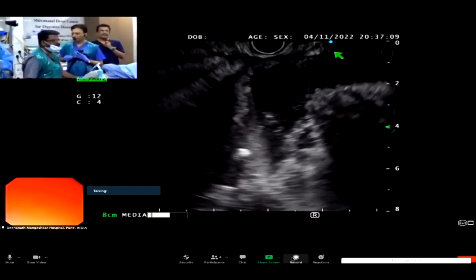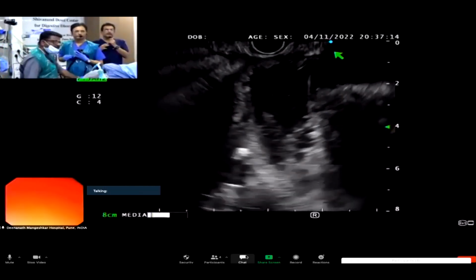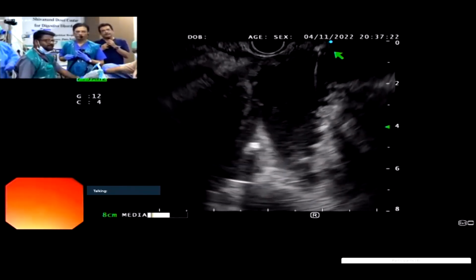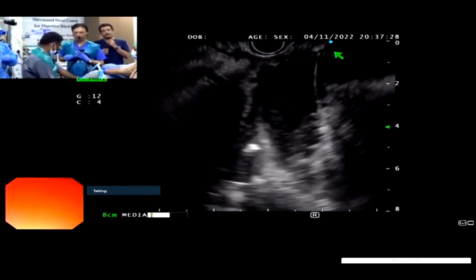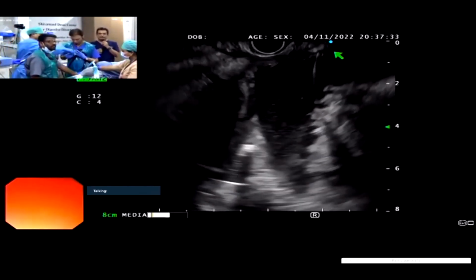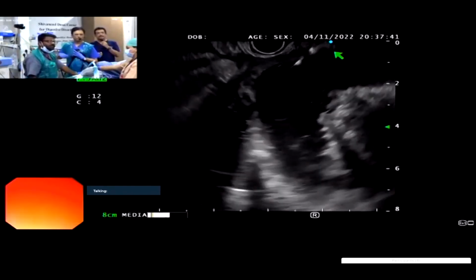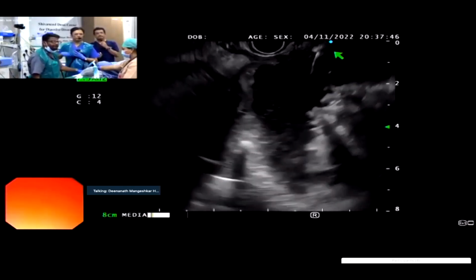The MITech plumber stent is a derivation of the Nagi stent. Its distal flanges are curved inward so that the chances of traumatizing the bed of the pseudocyst or the cavity are much less with this kind of a stent. Of course, it has been our policy to also place a double pigtail stent through the metal stent to avoid the metal stent from impinging into the wall of the collection. So that is our usual policy. We'll see Rajendra doing that. So maintain this guide wire position well.